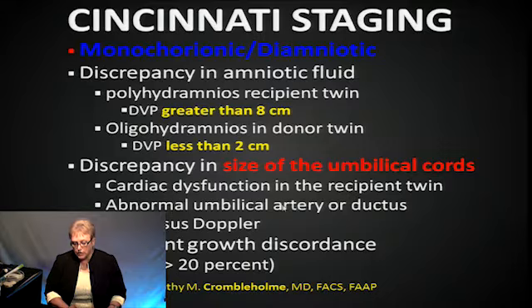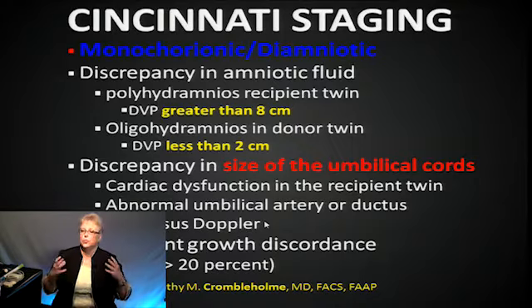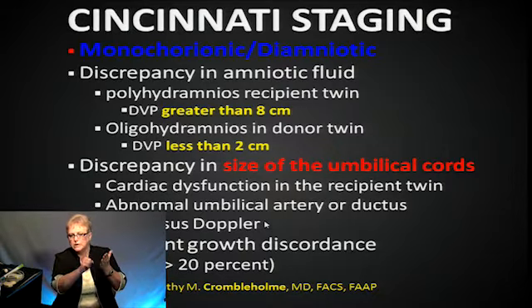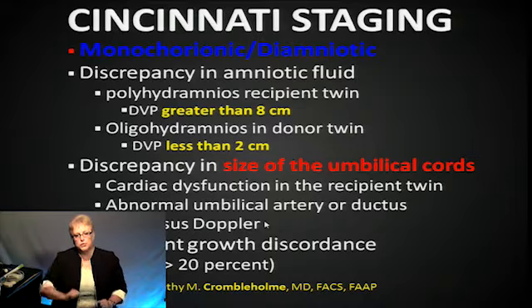to intervene. One of the things that I've learned since I've been at Texas Children's Hospital is even when you see this and you know that it's going to end up having to have the surgery done, they're waiting until there's enough fluid in there so it's actually thinning the placental mass out, because they want it as thin as possible because they're looking at the surface vessels on the placenta and they're going to ablate them. So they want to have that polyhydramnios in there.